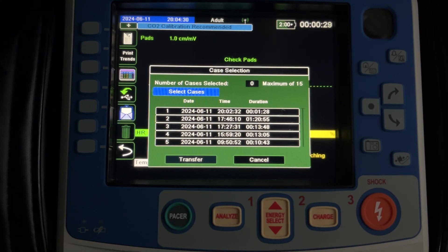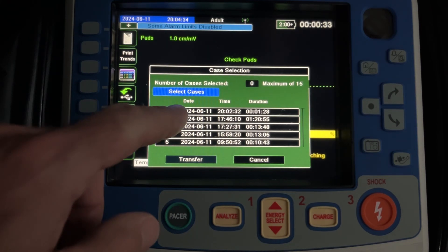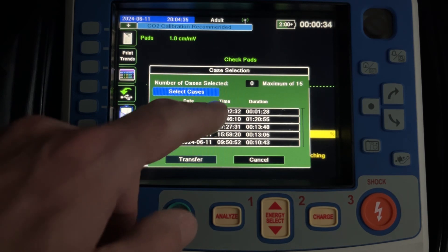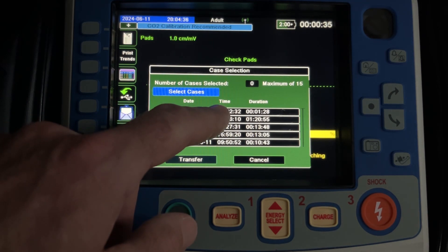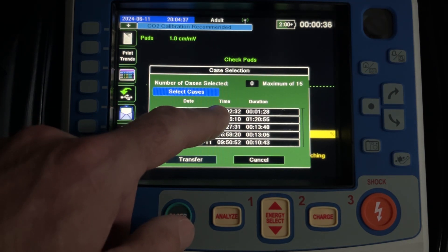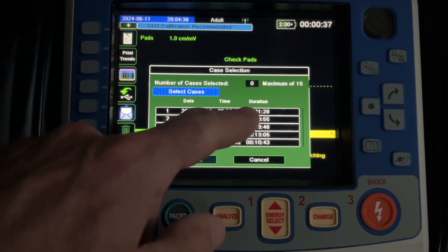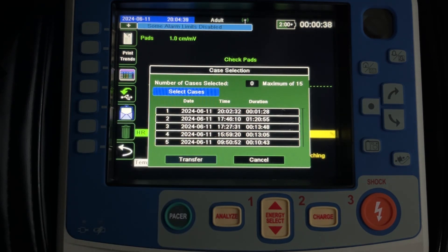You're probably going to pick the first or second call in most scenarios. But just as a check, the date, the time of the call from when the monitor got turned on, and the duration of the call will be listed here as well to make it a little bit easier for you to pick the correct call.